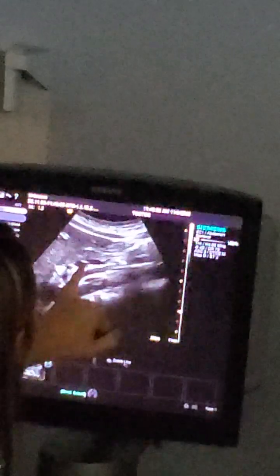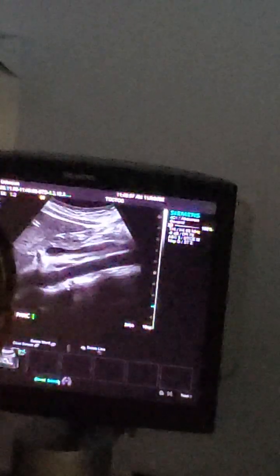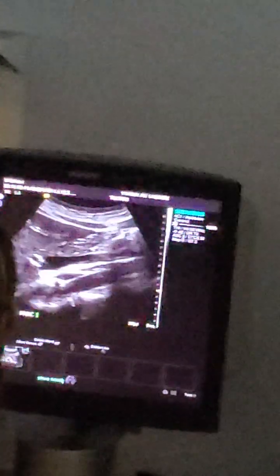We're coming back towards her right side. This is now going to be the portal splenic confluence, and you can see where that SMV and that IMV come right in there. So this is our Pank hamburger. We have a lot of buns in here.